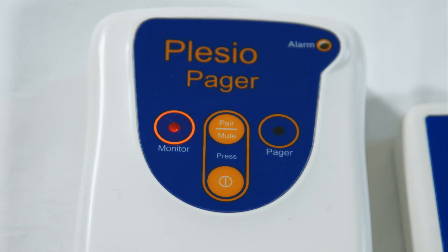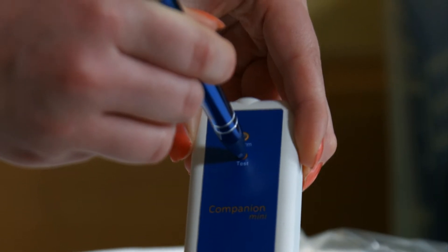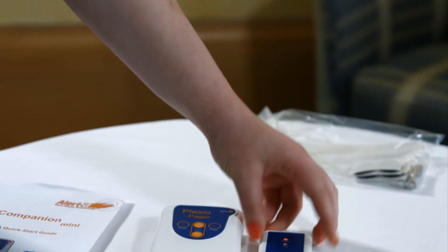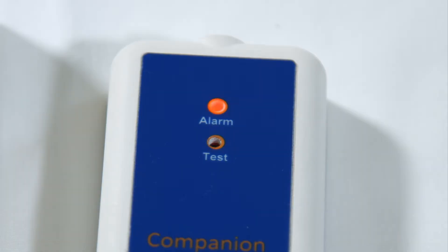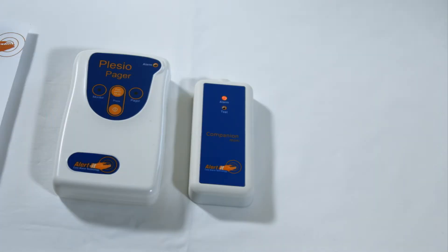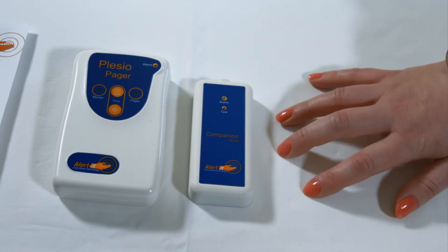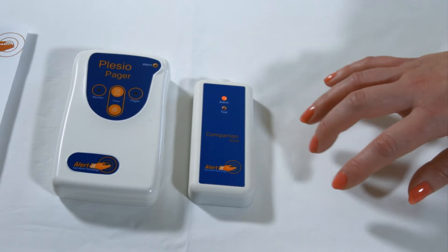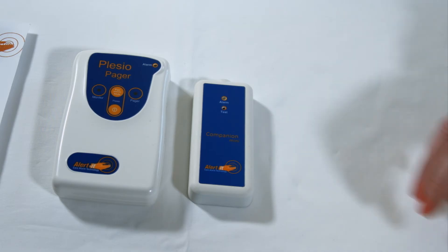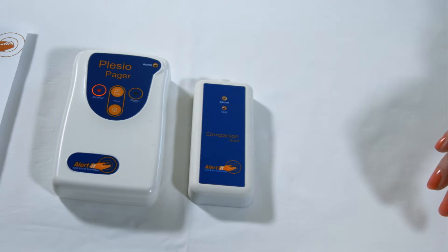Before we position the Companion Mini in place, it is necessary to ensure everything is in working order. You will need to press the Test button in order for your monitor to enter the 60-second test mode. The internal red light should now be lit. Simply place the monitor and Pager on a table or equivalent surface and begin tapping to simulate seizure movements. When doing so, the Pager should beep and the monitor LED flashes, signalling that the Companion Mini detected a seizure movement.